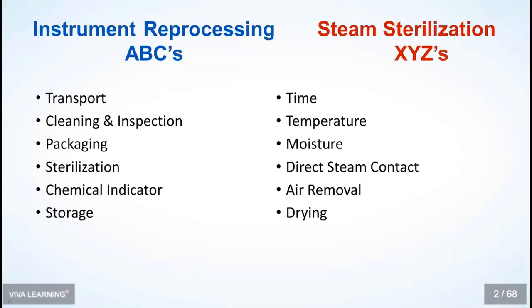Temperature is a big deal because the higher the temperature in the sterilizer chamber, the less time is needed to achieve sterilization. This is particularly effective when we talk about steam sterilization, which is the number one choice for dentistry overall. We also know that pressure is involved with temperature, so the pressure helps to elevate and maintain the temperature during the cycle.